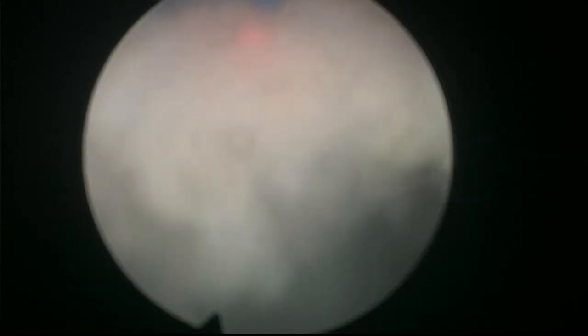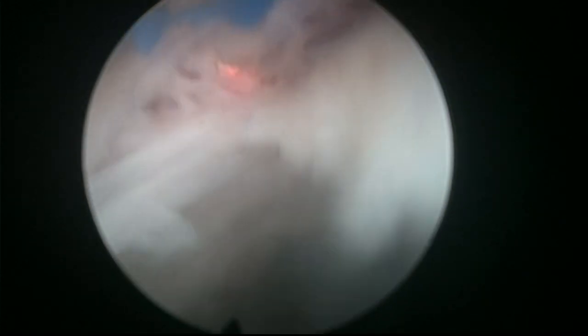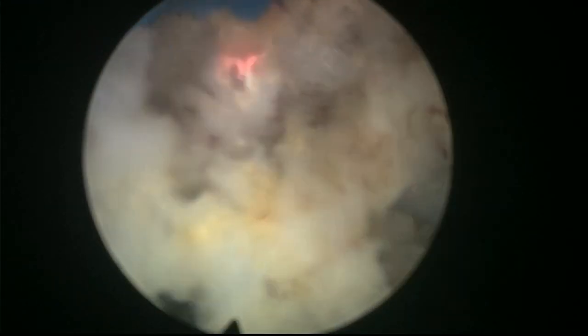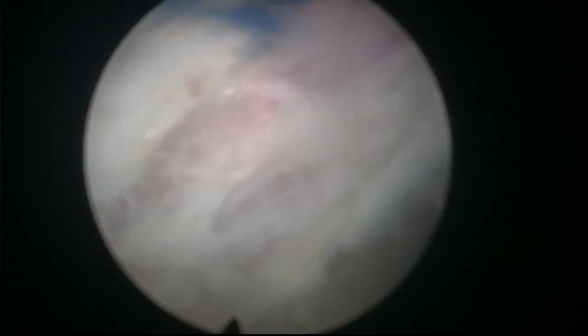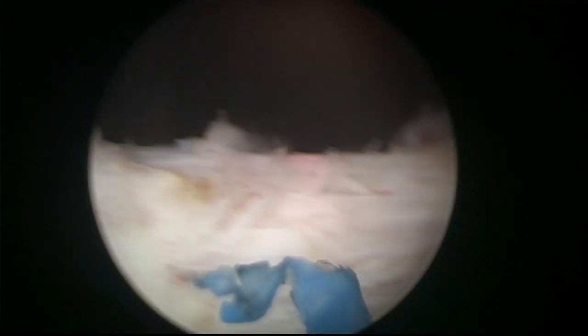If you want to complete the removal of a little bit of tissue that was left behind, you can perfectly do it at the end. This is the trimming phase. Sometimes you have very beautiful planes, and sometimes there are some cling-ons — small fragments of tissue that are hanging. You can just take them out while you check your hemostasis. I think this is it — beautiful. So let's move on now to morcellation.